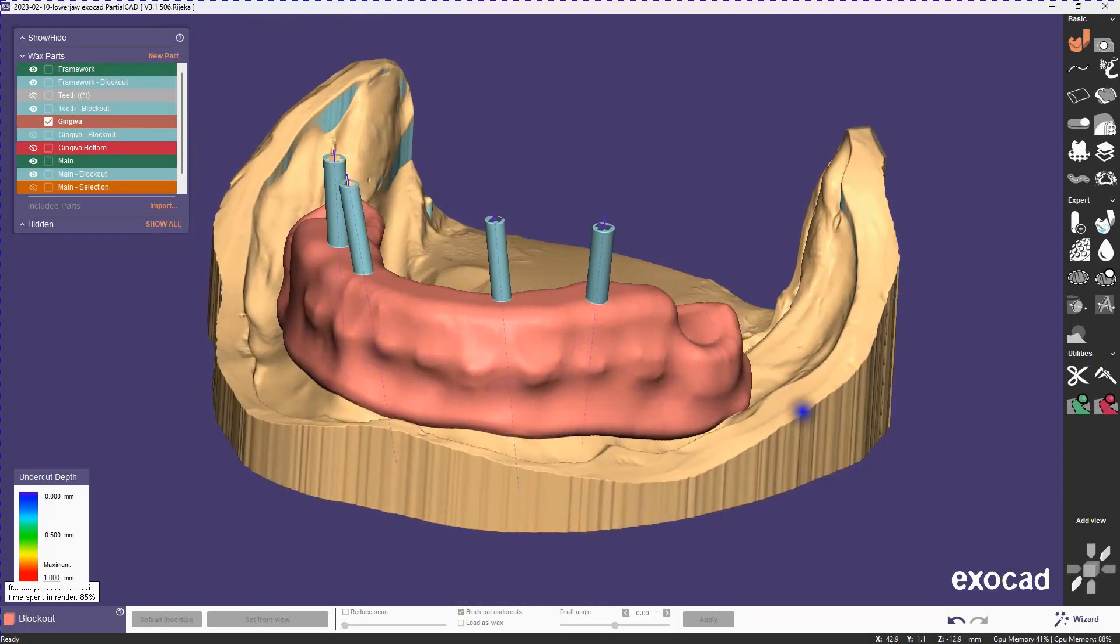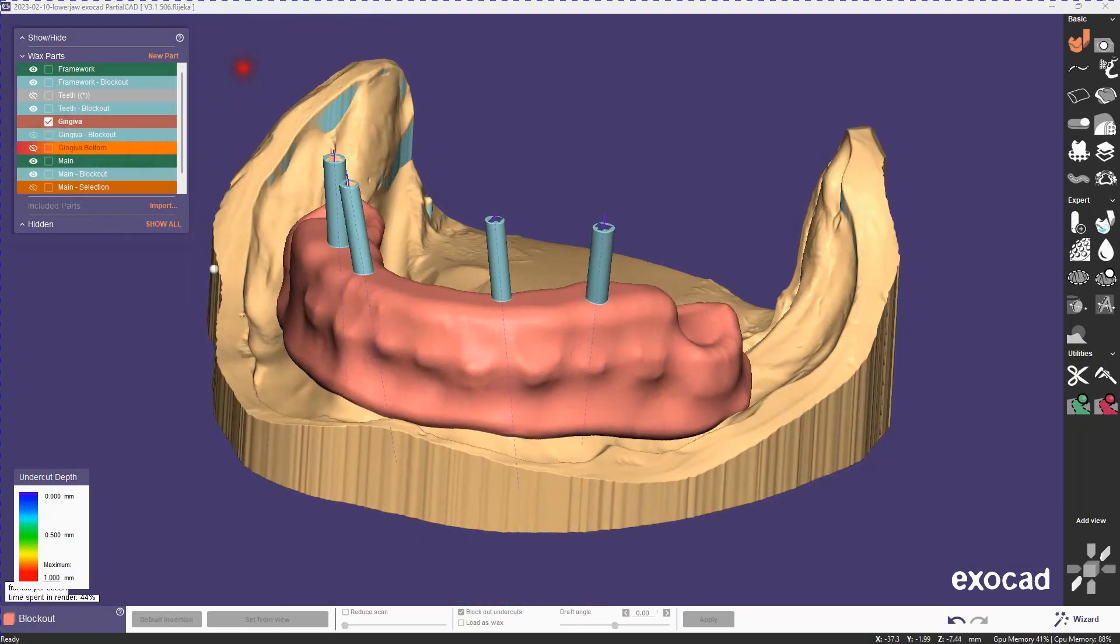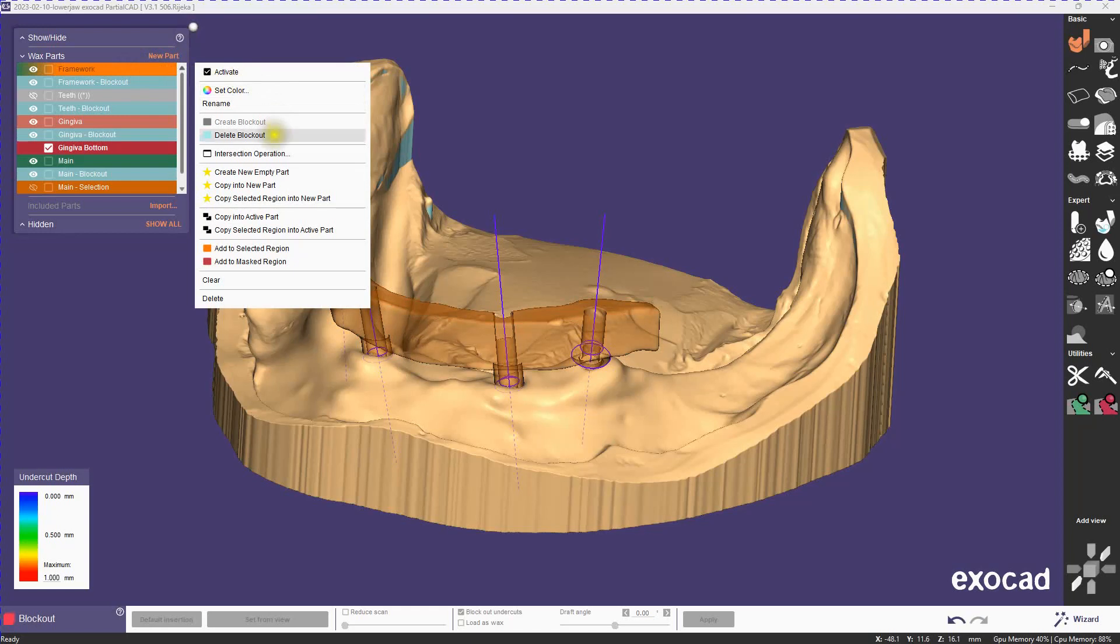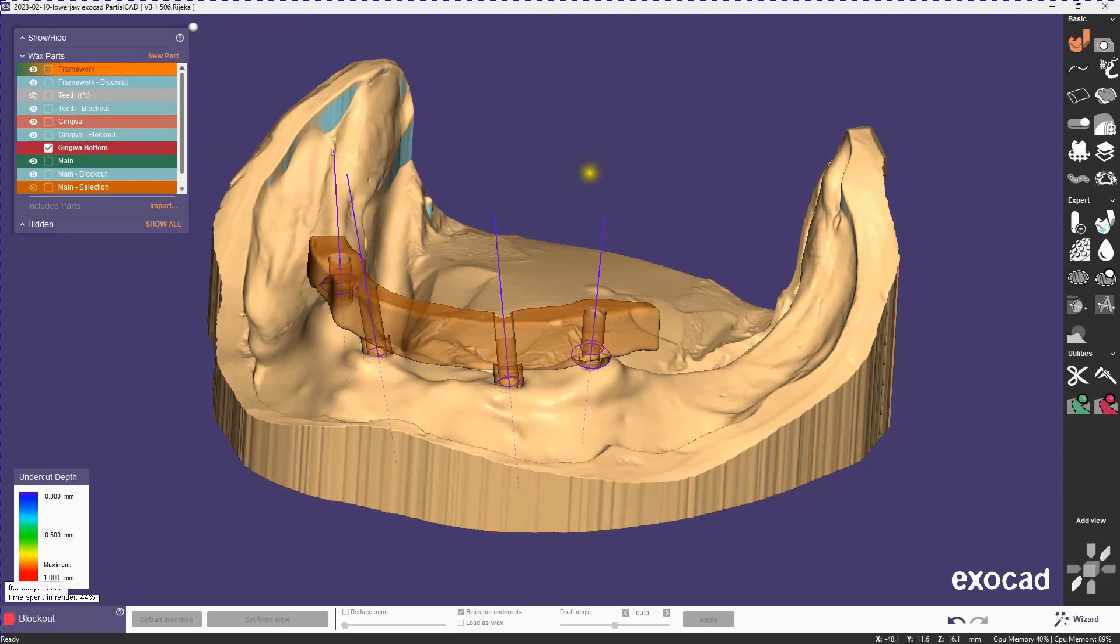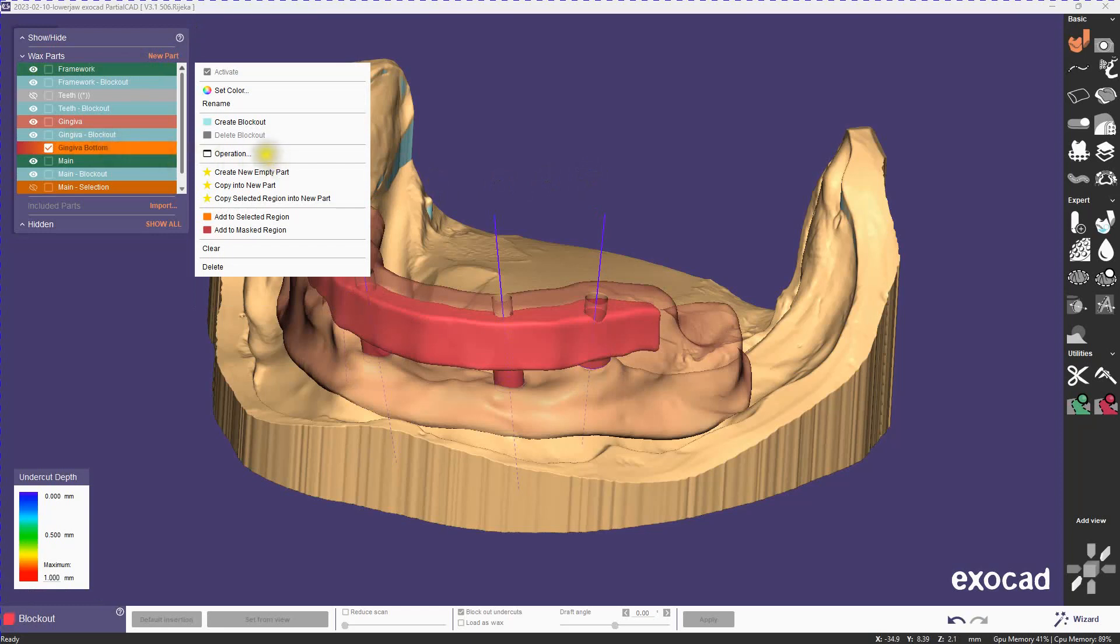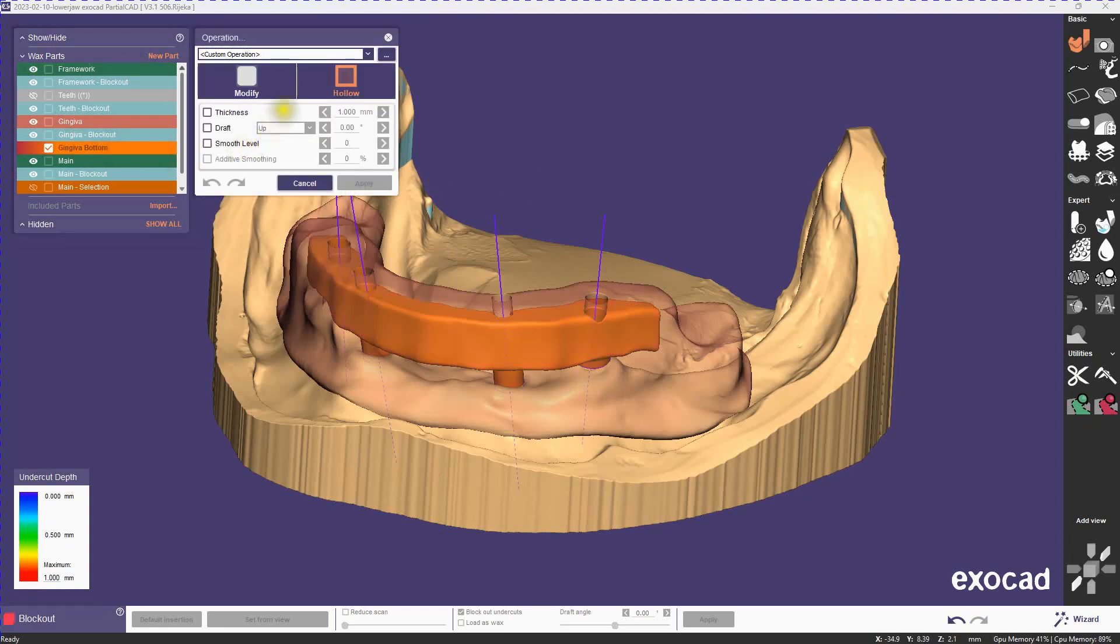Let's start working on our bottom gingiva, which we have to do manually. It's actually not that hard. I'll start by activating it. We're going to take a copy of our framework and put it into the bottom gingiva, and then we're going to draft that down, which will give us a good starting point.